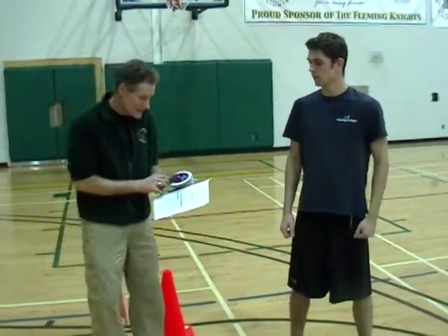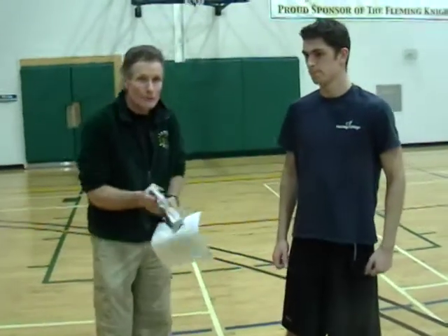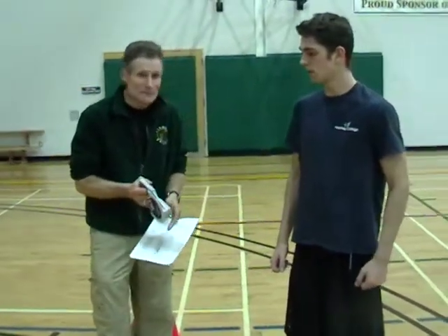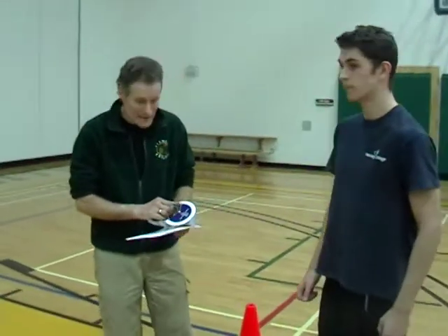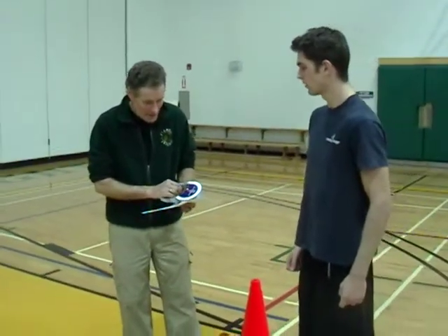The next test is the hand dynamometer test. This test measures your forearm and grip strength, which is very important in the field of policing. And Julian's going to give it a try here.